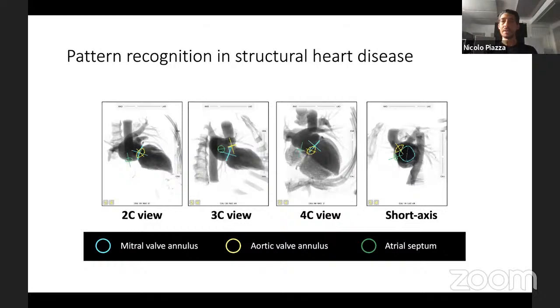And so because it's en face, because the aortic valve has been separated from the left atrium, the three-chamber view, RAO caudal, is the best view to allow you to understand whether or not your transeptal needle, which should be pointing into the screen in RAO caudal, is away from your aortic root. That's how you separate what's anterior and what's posterior. Anterior mitral valve leaflet, posterior mitral valve leaflet.